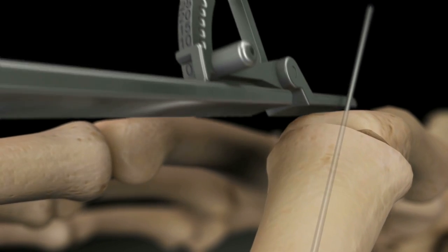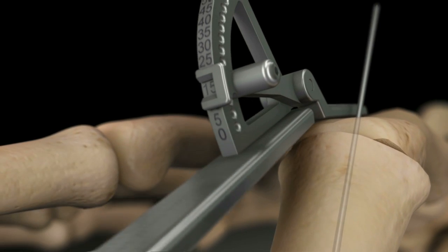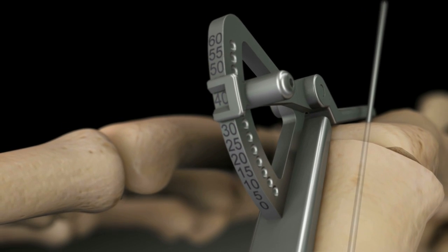Retrograde the K-wire into the channel of the distal bone and reduce the joint. Use the goniometer to confirm the angle of the fusion.